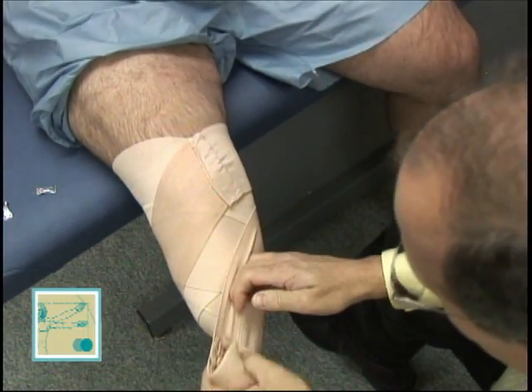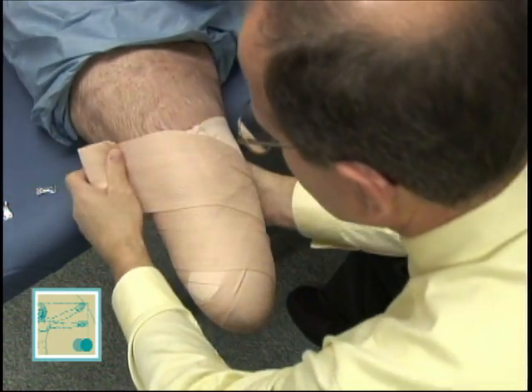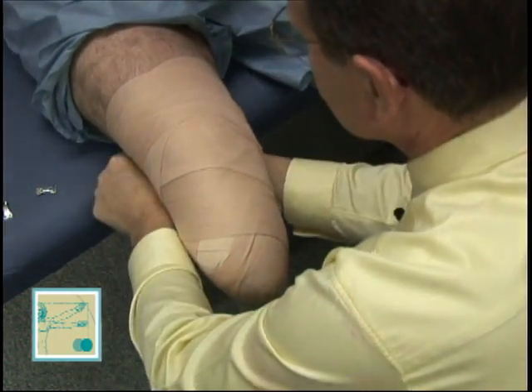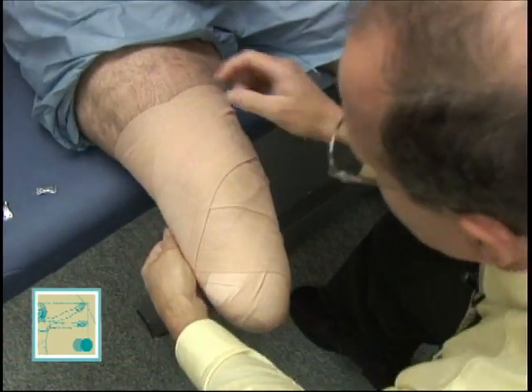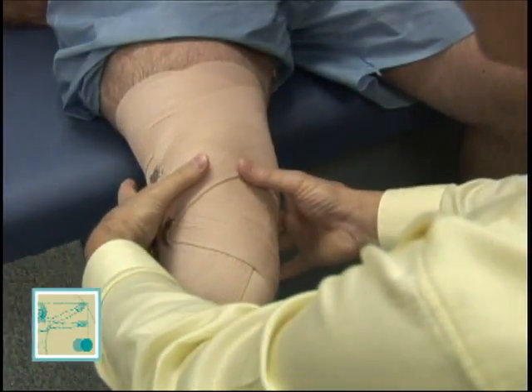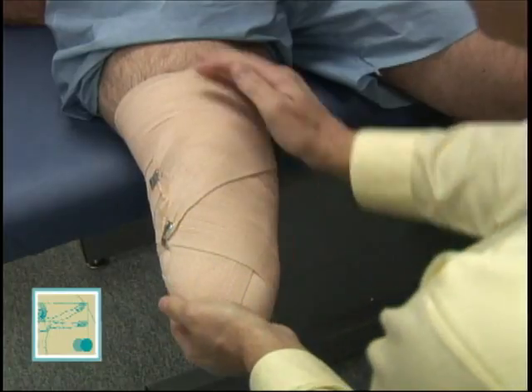I want to make sure my technique is good, so I'm going to come down here and put compression on that area. I'm going to keep moving proximally. Again, as I go up, the tension is less. I want to bring the wrap to about two inches proximal to where the trim line will end — in this case, about two inches above the attachment of the adductor magnus. Now we have a wrap that has more compression at the bottom than at the top. There are no circumferential wraps to create any venous tourniquets. The blood flow is supported, moving distal to proximal because there's more compression distally than proximally.